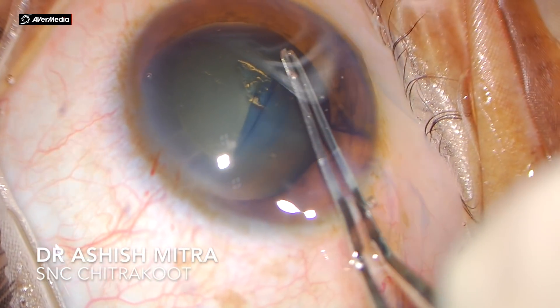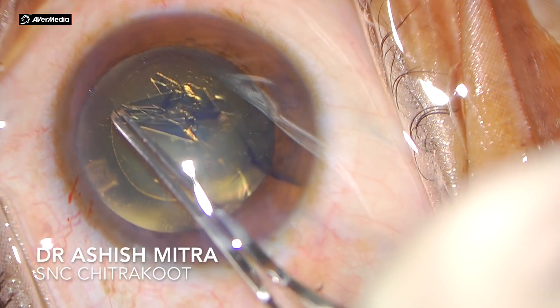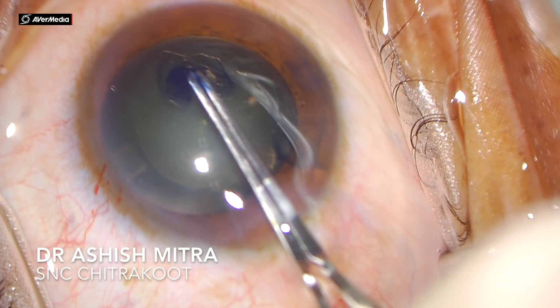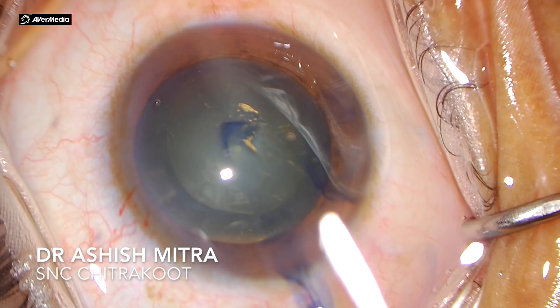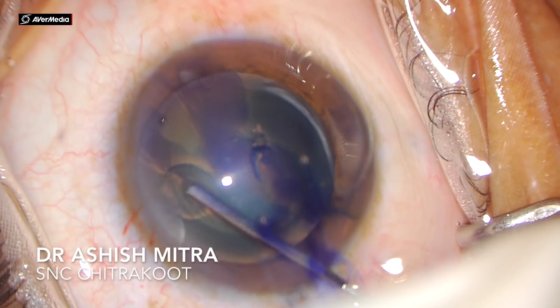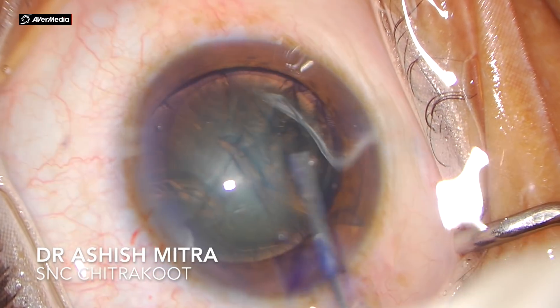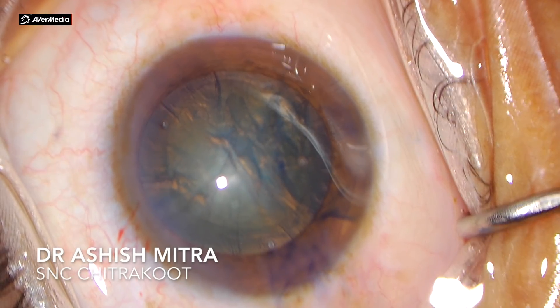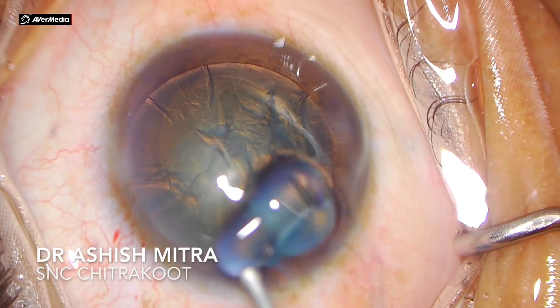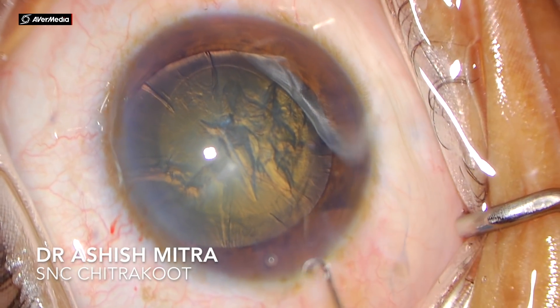Capsulorhexis is a crucial step in all phacoemulsification surgeries, so you have to be very careful with your rhexis. When you are a beginner there are chances that you land up with complications, so if you have an intact rhexis there is always a chance to implant the IOL in the sulcus. Whether you are comfortable with Utrata forceps or with a cystotome, your rhexis should be perfectly fine, as that is one of the prerequisites for doing phaco.